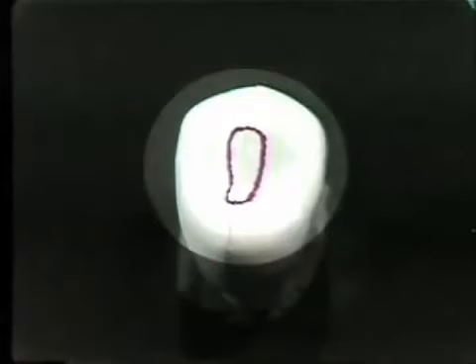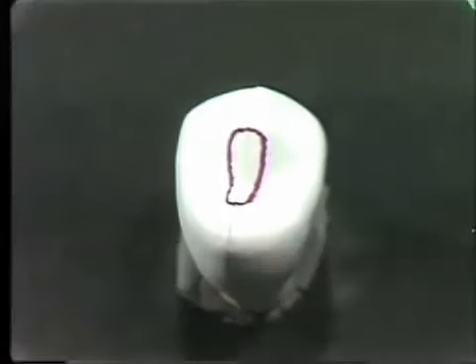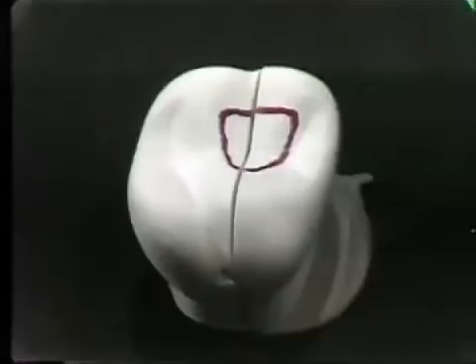In the maxillary bicuspid, the pulp is so narrow mesiodistally that students have been gouging the tooth in that direction. To guard against this, after you drop into the pulp chamber with the number 4 low-speed round burr, switch to the flame-shaped burr to unroof the pulp chamber. Put the burr into the channel that you prepared to the pulp and extend in the buccal lingual direction only.